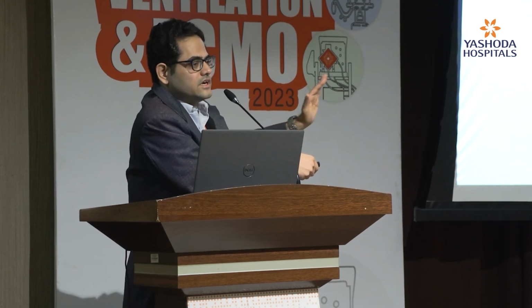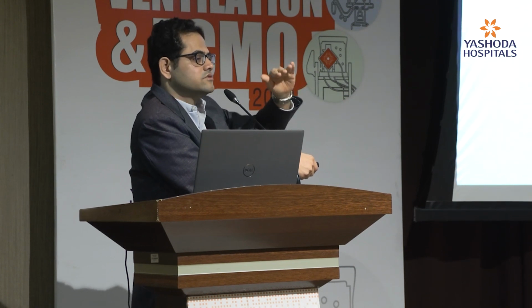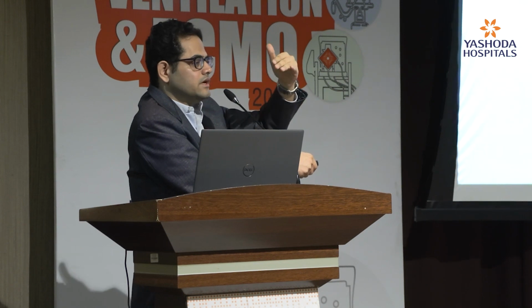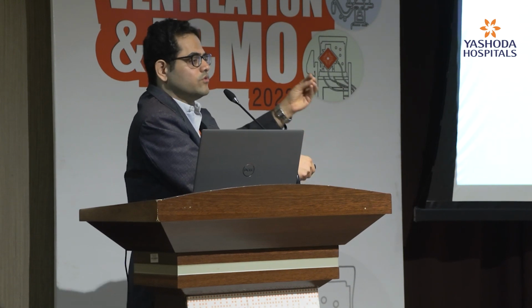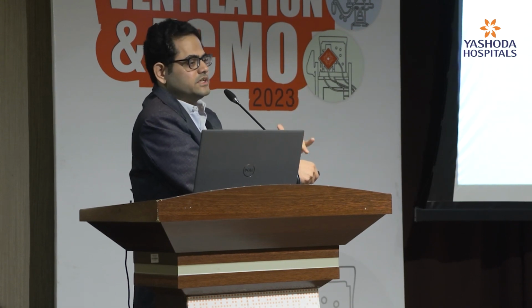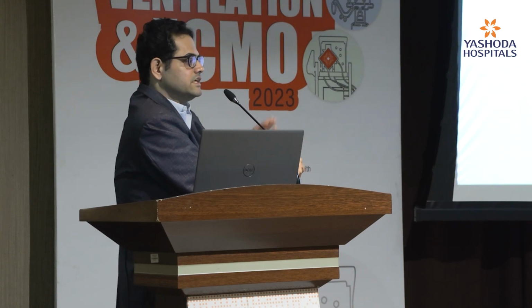So again pressure limited. Here the only factor governed by the ventilator is pressure. All the rest of the parameters are governed by the patient, except that flow, if the flow is reaching 25%, depending upon what we keep. You can keep 25%, you can keep 40%. So the ventilator goes from inspiration to expiration, cycling happens. Okay. So then what is the SIMV?